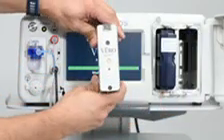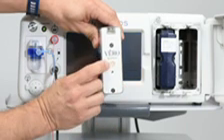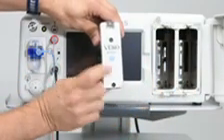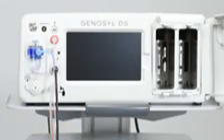Verify the color of each cassette state window. The ones that are no longer blue have been used and can be discarded per your hospital policy. The ones that are blue can still be used. Close the cassette access door.